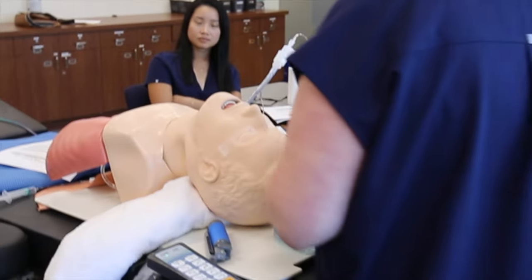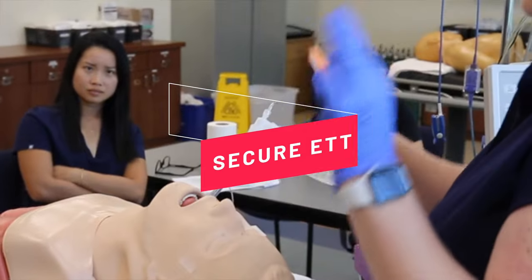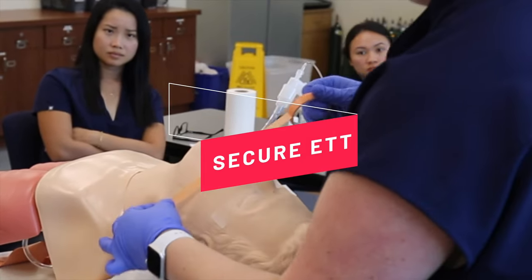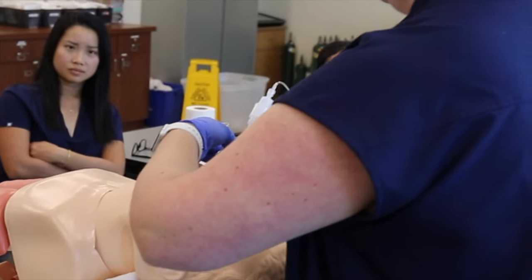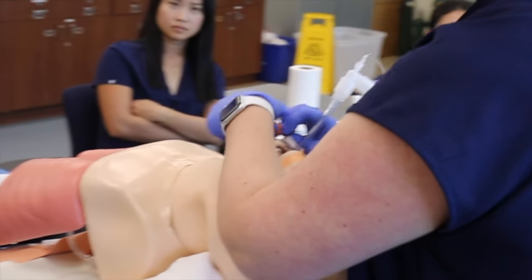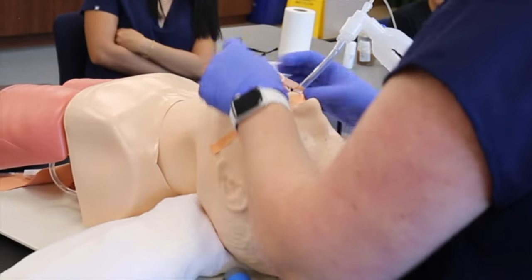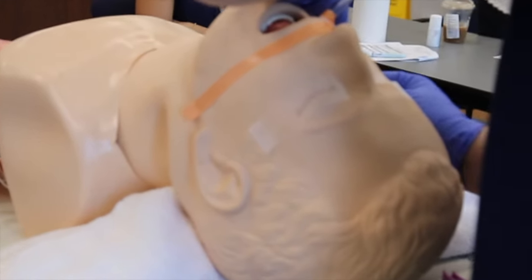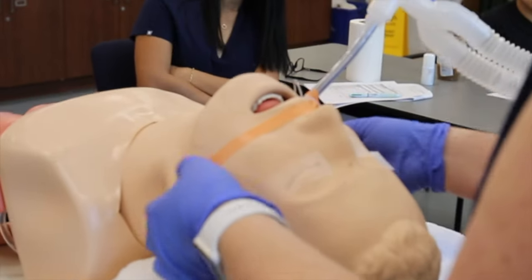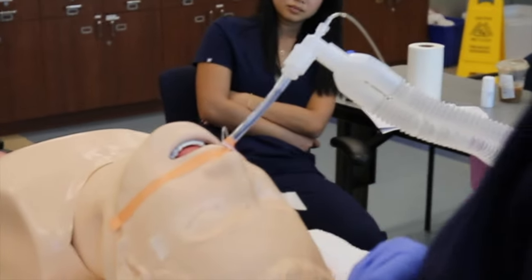And at this point, once I've made sure everything's all good, I'm going to secure the tube. So we'll do this one more time. Taping the tube. I like to tape right from the roll. I start at the left side of the face, make a little mustache, and hug the ET tube down by the lip. Don't walk the tape up the tube. You're just going to wrap around itself one more time. Make a little tab there at the end too, so you have a tab on each end. There is very little tenting here, and that is a very secure tube.